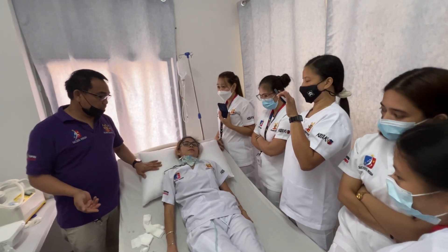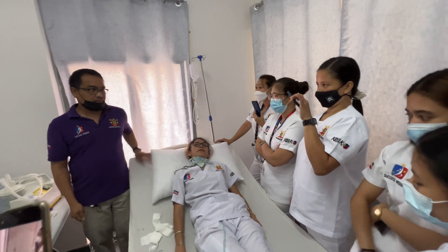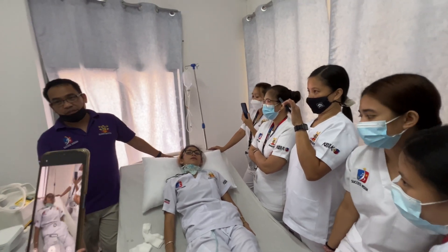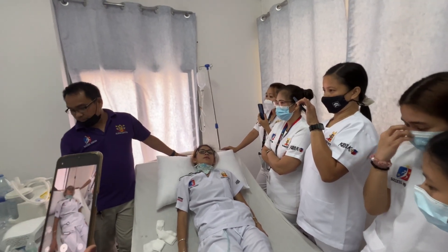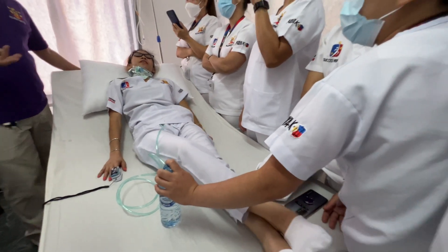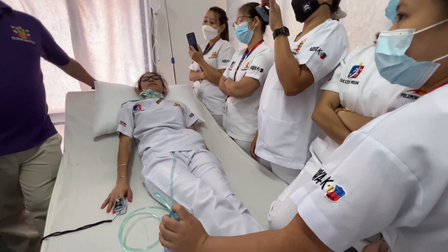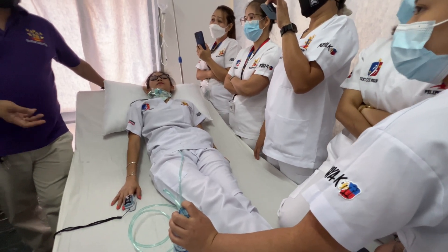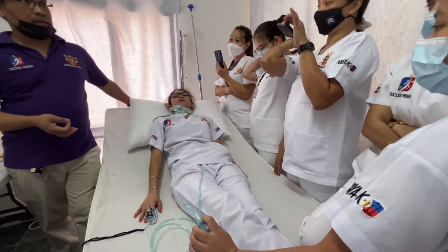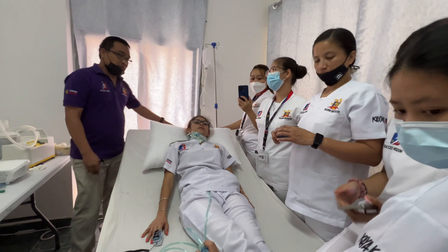I was going to perform the nebulization first. Before you attend to the patient, you have to pre-assess yourself first. If the patient has difficulty breathing and has asthma, you need to administer a bronchodilator to loosen the secretions. Kindly put 0.5 of Ventolin.